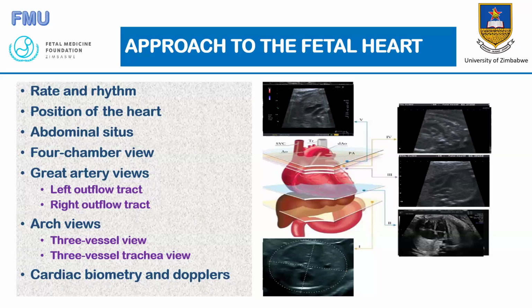The next thing, you want to do the arch views, which are the three vessel view and the three vessel trachea view. Then, of course, if you are doing an extended fetal echo, we are going to do the cardiac biometry and Dopplers. But today's talk will probably end at the three vessel view. We just want people to be competent in terms of screening the fetal heart conditions.